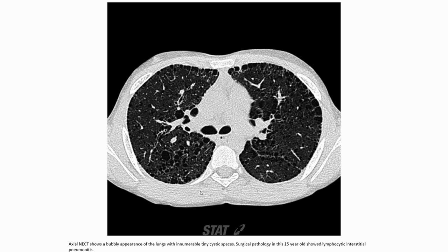It's axial non-enhanced CT, showing a bubbly appearance of the lung with innumerable tiny cystic spaces. Surgical pathology in this 15-year-old patient showed lymphocytic interstitial pneumonitis.